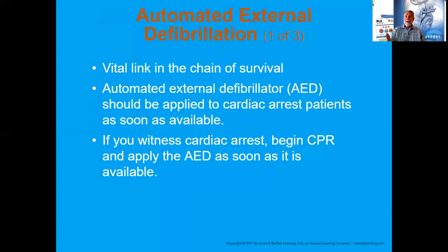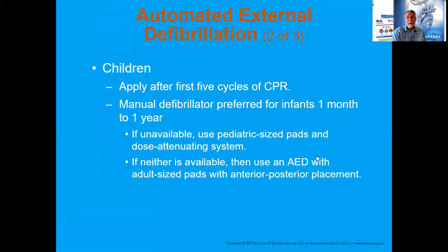If you do witness cardiac arrest, begin CPR and put the AED on as soon as possible. That is in line with that skill station that I was referring to. For children, it would be ideal to start with 5 cycles of CPR and then put the defibrillator on that child, just because you're returning that oxygen via your compressions and the breaths. Manual defibrillation is preferred for infants, which are classified as 1 month to 1 year of age.